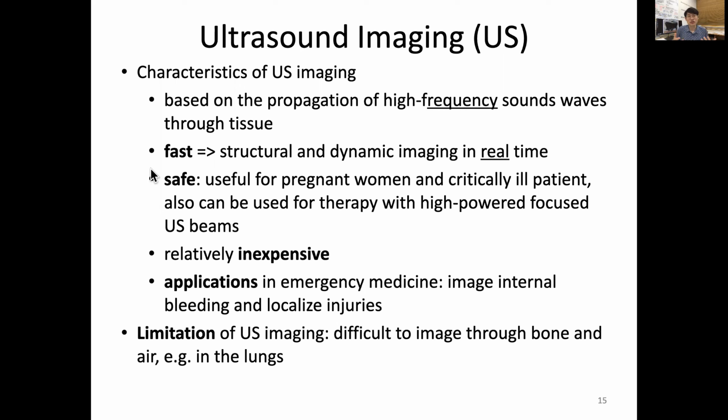Unlike the X-rays and CT I discussed before, which use ionizing radiation, now we are talking about sound waves and ultrasound. So that is non-ionizing radiation. So this is safe, so that we can use it for pregnant women. You remember, for pregnant women to see the child inside the belly, and also for critically ill patients.